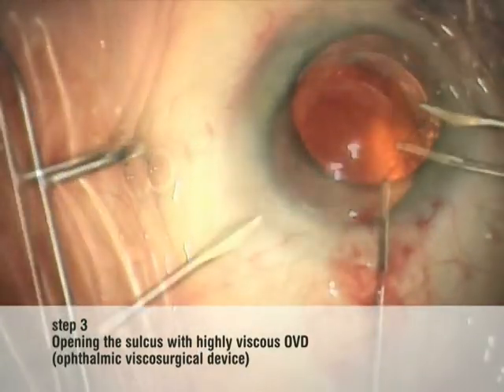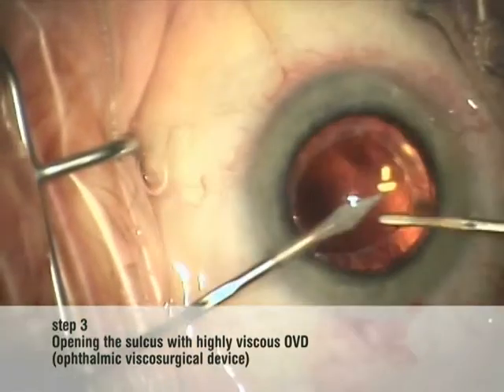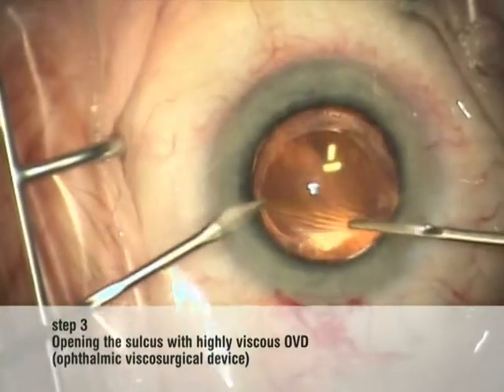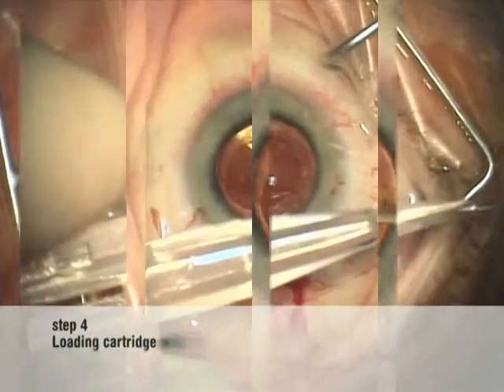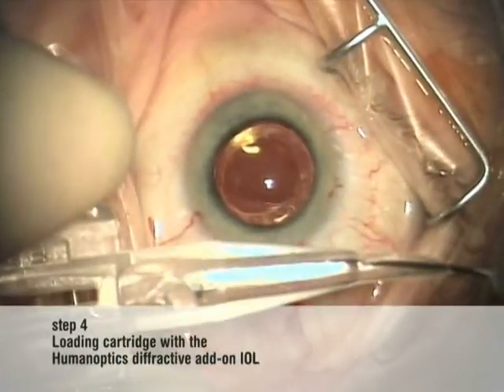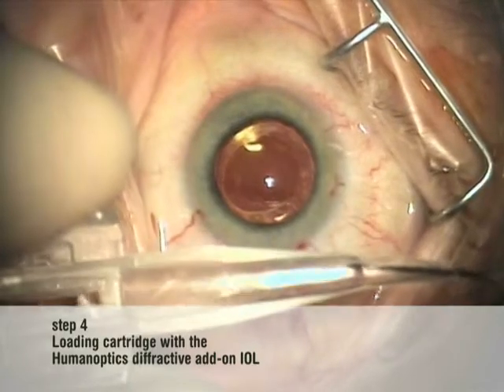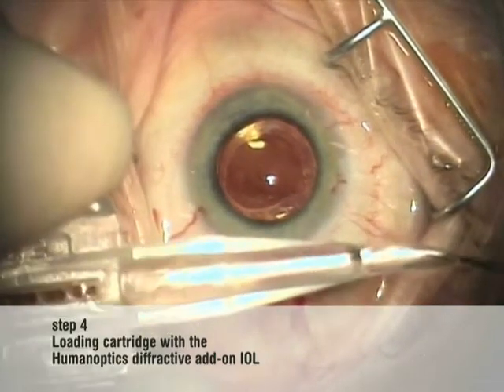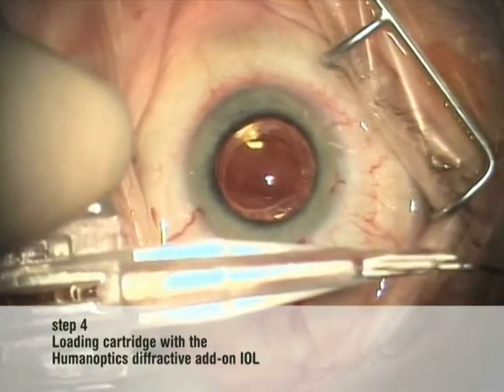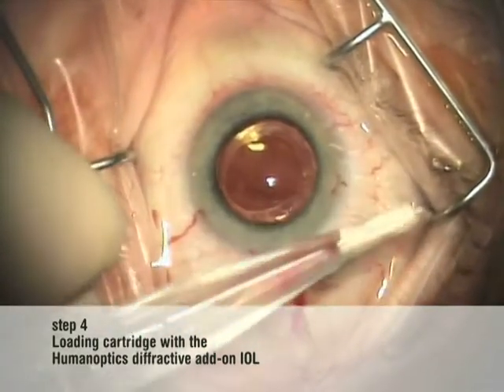Two paracentesis incisions are made. The cartridge is filled with highly molecular viscoelastic all the way. We use the Hoyer injector system to implant the Schmidt Human Optics add-on IOL.